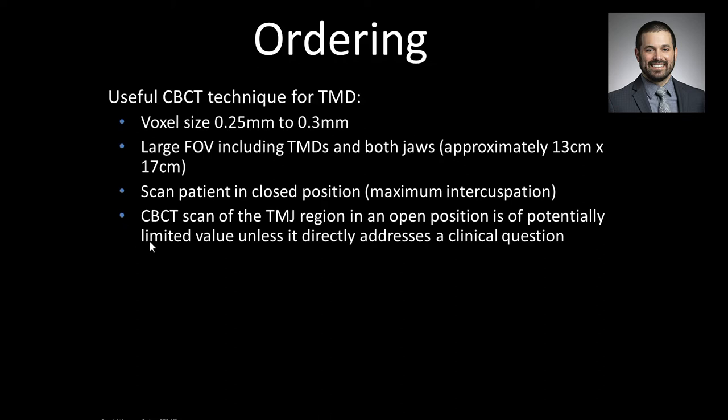There's some discussion and different opinions about ordering a cone beam CT scan with the patient in an open position to assess the condylar position. One thought is you can really document where that condyle is. Other thoughts are that you can really figure that information out clinically. Without getting into the weeds, it really depends on the specific clinical question whether I recommend having the patient scanned in an open position or not.